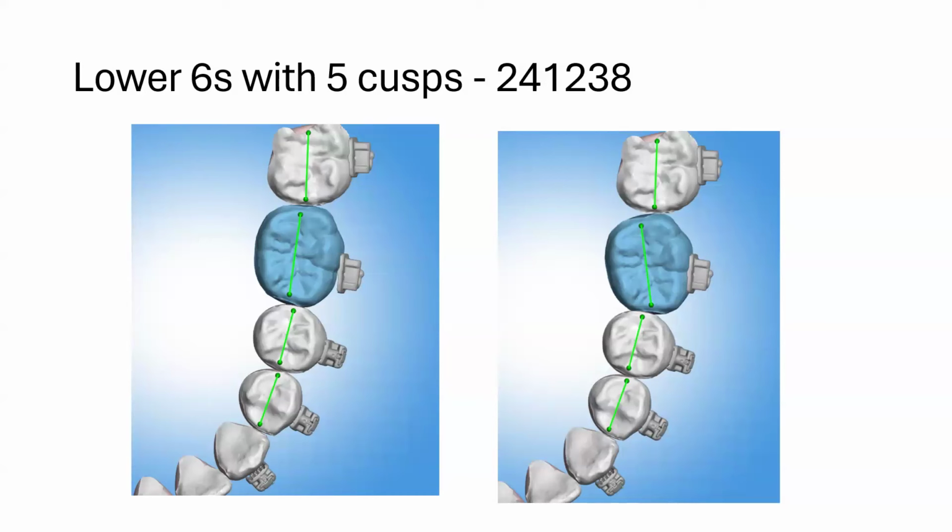So pre-adjusted appliances, that's what Larry Andrews created. The Pitts bracket system is not only pre-adjusted for an ideal outcome, but it is pre-activated. The pre-adjusted versus pre-activated distinction is an interesting concept. If you look at the amount of torque that is built into those upper first and second molars, it's quite a bit. It's a lot of buccal root torque. It's more than we would ever want to see clinically, but we're not going to see that clinically.